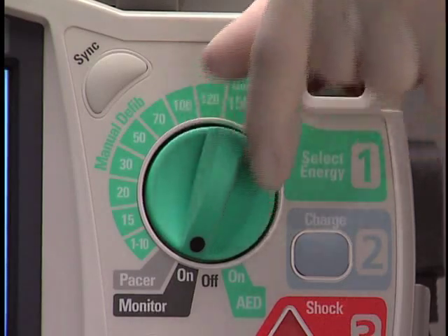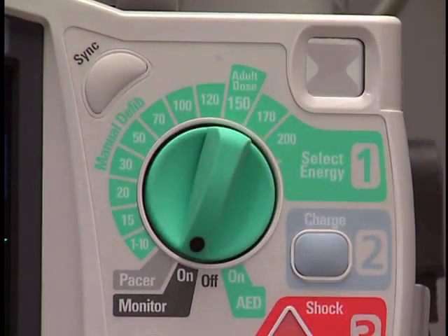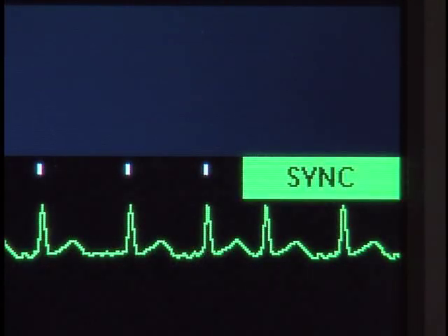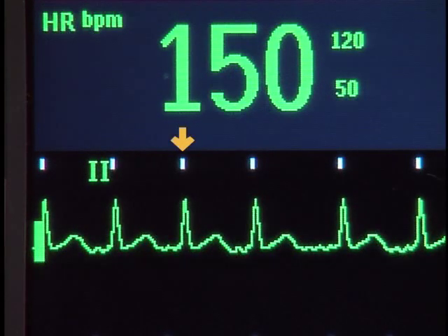With the therapy knob in the monitor position, press the Sync button to activate the Sync function. This message appears. Confirm that the Sync marker appears with each R-wave.